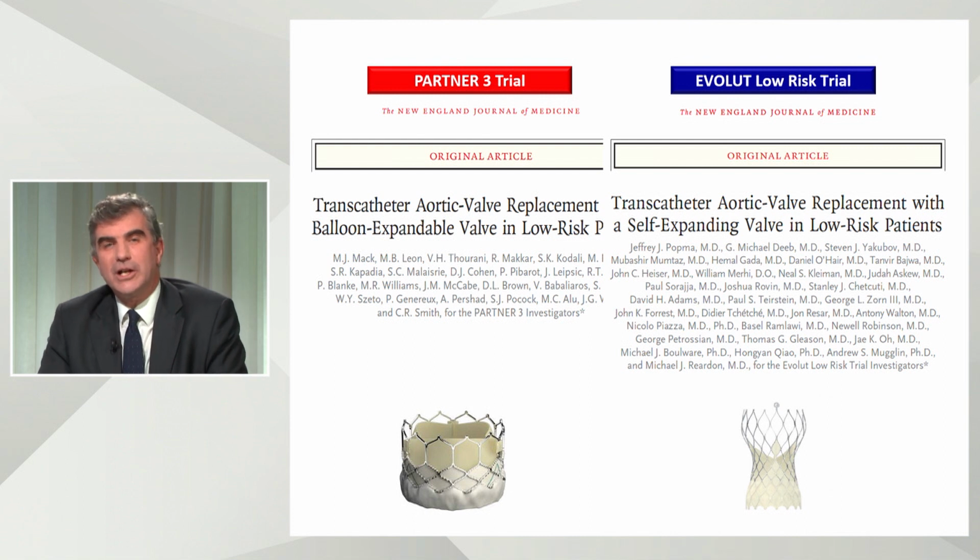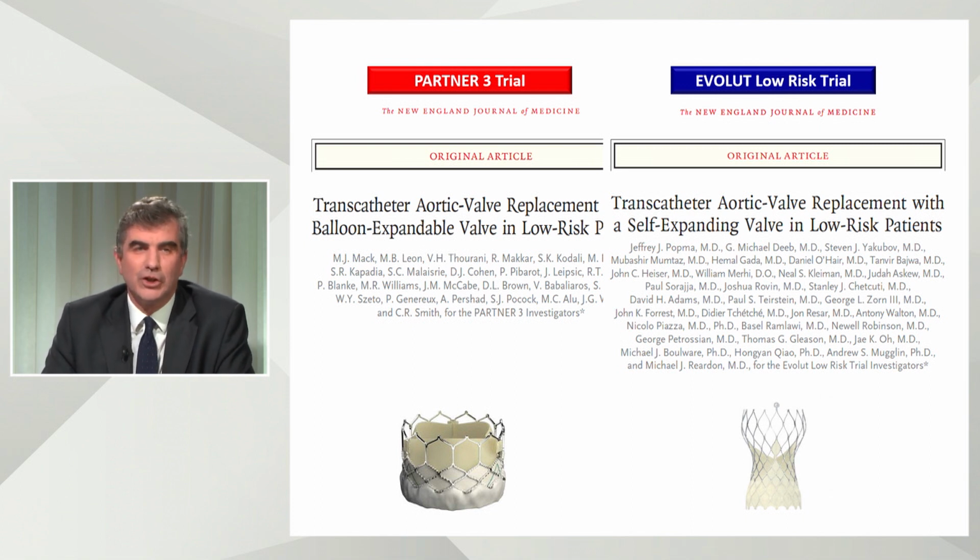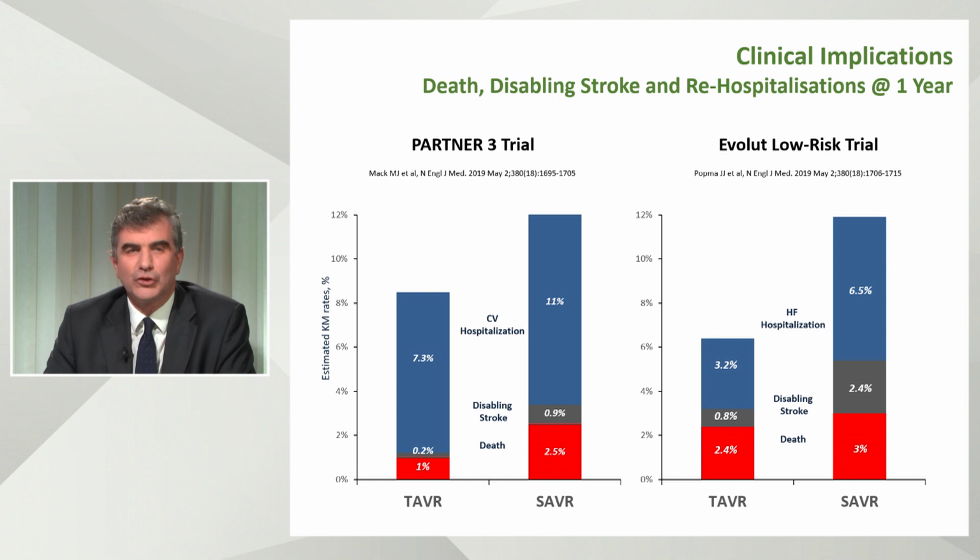Now, 2019 has been labelled as a leap year for heart valve disease and for intervention in heart valve disease, and that's partly because of the publication of the low-risk trials in TAVI earlier this year, when we were able to observe that in comparison with surgical counterparts, transcatheter technology was associated with vastly superior outcomes, particularly when you bear in mind the patient experience associated with a short hospital stay and a very quick recovery.